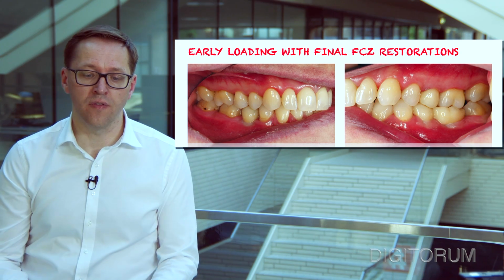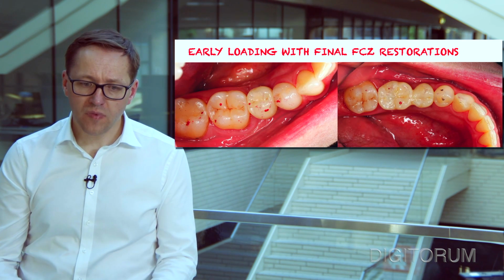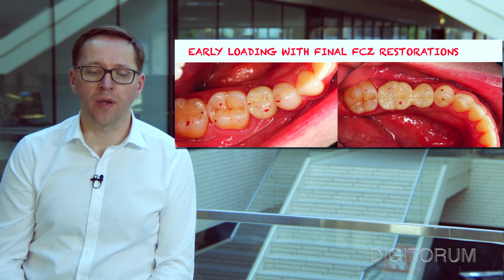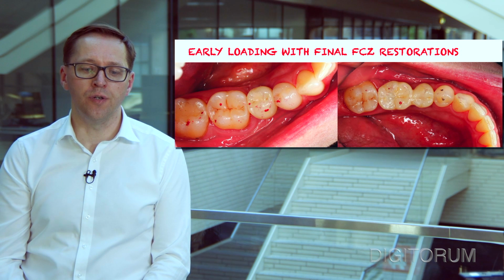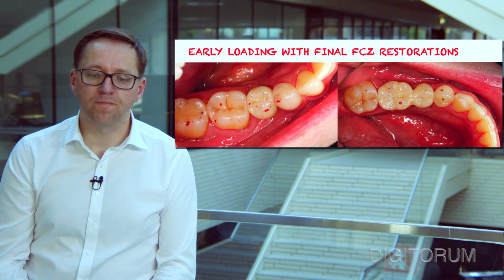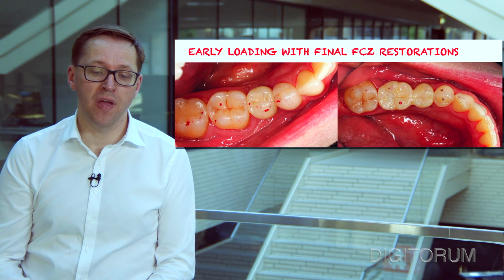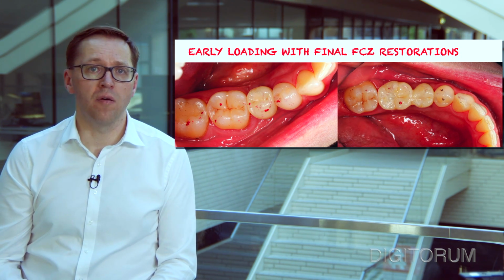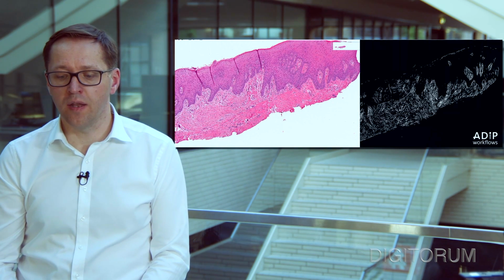2 weeks later, the restorations were inserted, X-rays were taken, and as you see, these restorations are in fully functional loading, and it's one of the options you can do with the aid of fully guided surgery, with the aid of digital technologies. And well, this, as I have already mentioned, increases the efficiency of your practice, and also offers some biological advantages for the soft tissues.